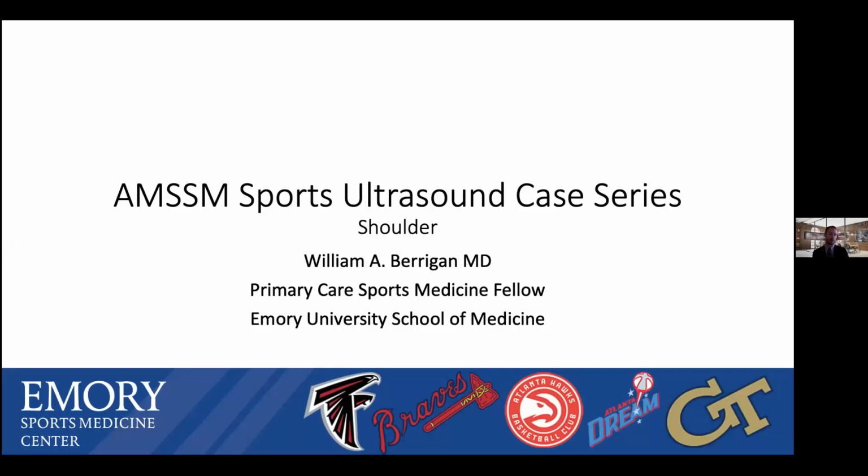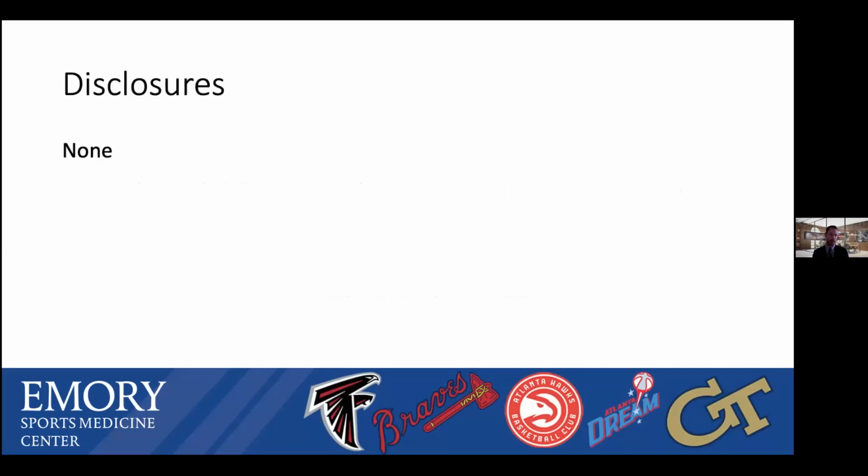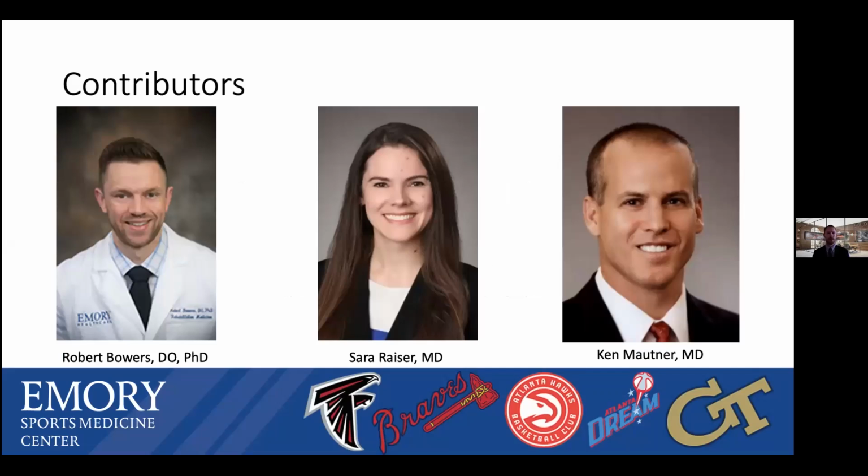So I'll be going over our standard shoulder protocol with a slight deviation based on our case presentation for this patient. I have nothing to disclose today.